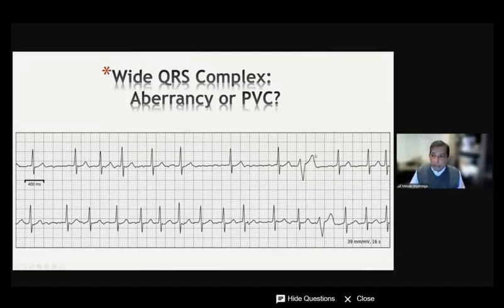Not always, because a ventricular ectopic also comes early, and that's why it's called a premature ventricular ectopic. But there's some clue here. You have to think it through. Look at this one. One clue is this interval, what we call a coupling interval. Coupling interval means when two beats come together, like a couplet, there is a fixed coupling interval between that and that. But you agree that that QRS is similar to that one. So the question is whether this is an Ashman beat or whether it's a PVC. And one clue is that this coupling interval is similar to that. That suggests this is a PVC.